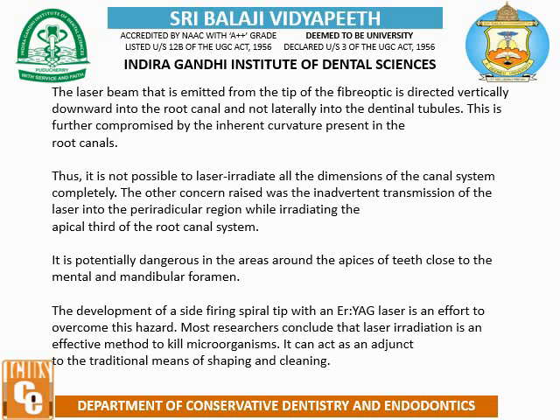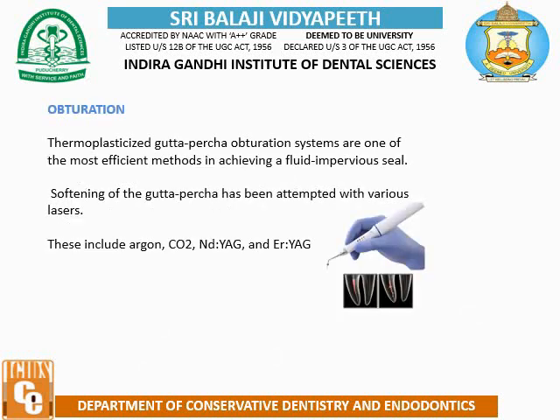Most researchers conclude that laser irradiation is an effective method to kill microorganisms. It can act as an adjunct to the traditional means of shaping and cleaning. Obturation. Thermoplasticized gutta percha obturation systems are one of the most effective and efficient methods in achieving a fluid impervious seal.